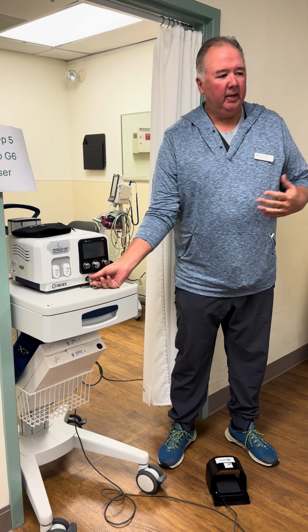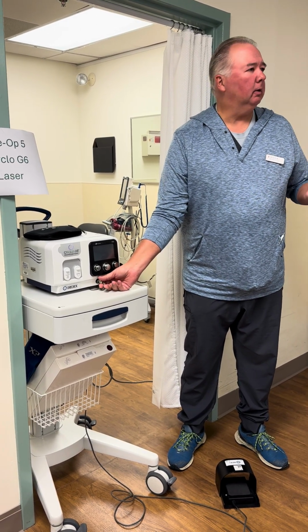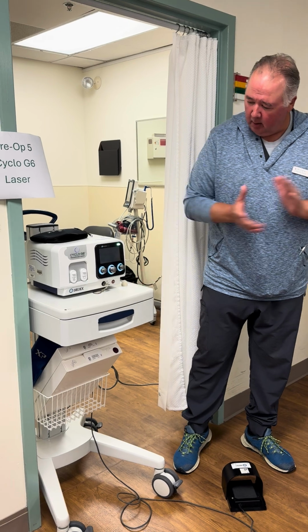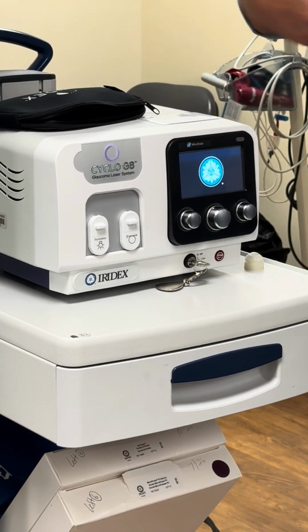So we'll get a little bit into the machine and what the probes are doing. How long do I have? As long as you need. Okay, I'm not going to be too long. Essentially, we're going to turn the machine on by the key. It's going to go through its little boot up cycle here.